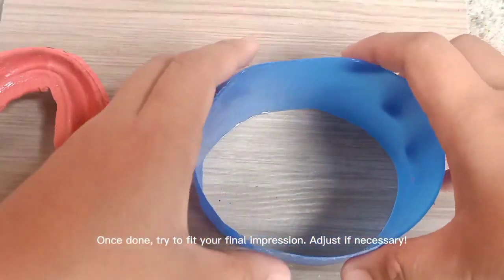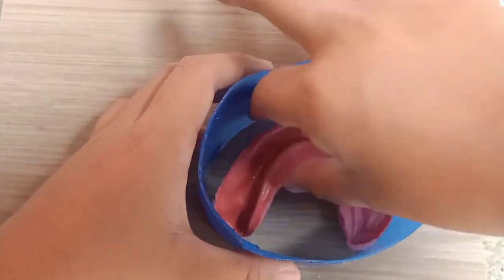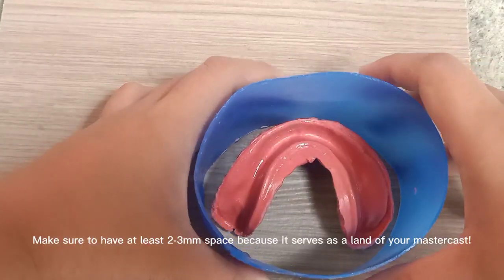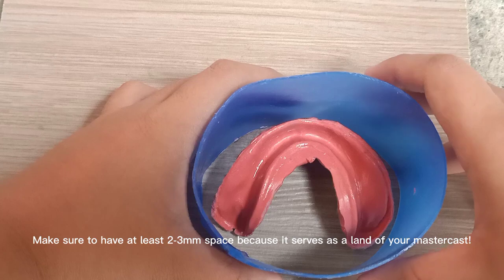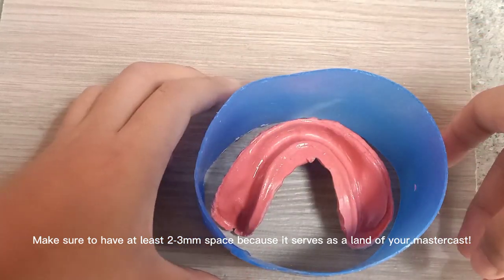Once done, try to fit your final impression. Adjust if necessary. Make sure to have at least 2 to 3 millimeters space because it serves as a land of your master cast.